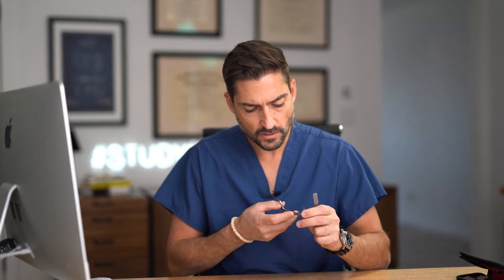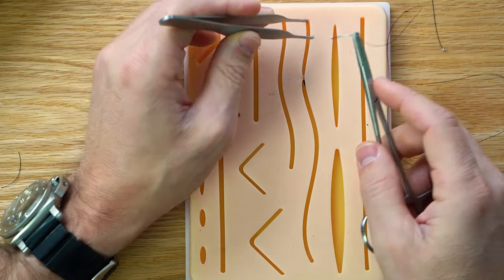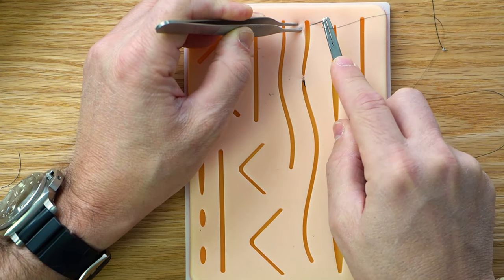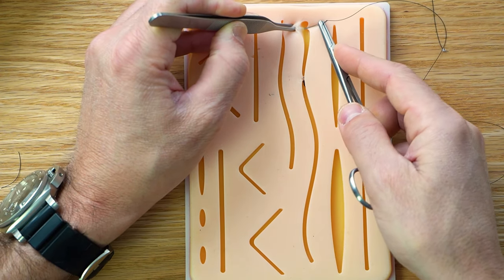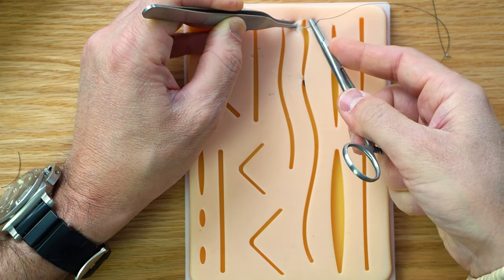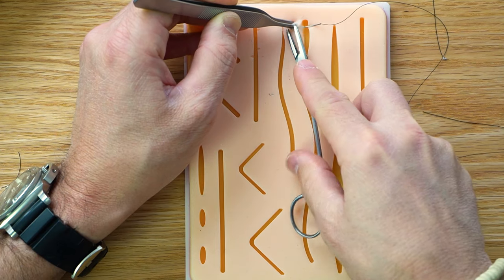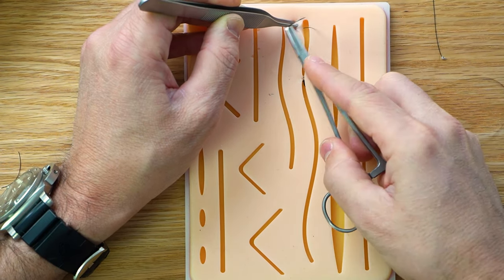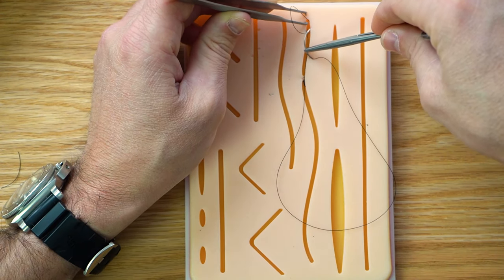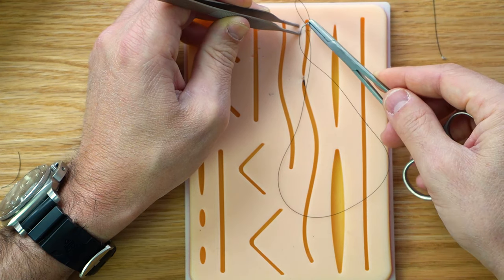So for a 5mm incision, like a port site for appendicitis or a laparoscopic appendectomy, or a lap chole or something like that, that's what I do, okay? Now, if I'm doing a running and I'm starting at this side, this is what I'll do. I'll do this first, and note that this rubber stuff is not exactly like skin, and so it does come apart a little bit easier. So you have to be a little bit careful if you practice on this, but you get a pretty good idea. And this is coming together the same as if it was skin. So I'll do this real quick.